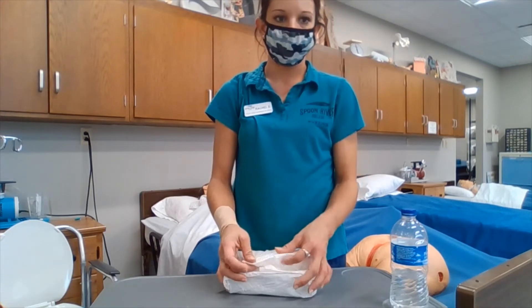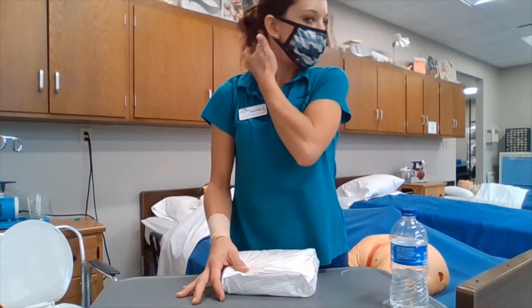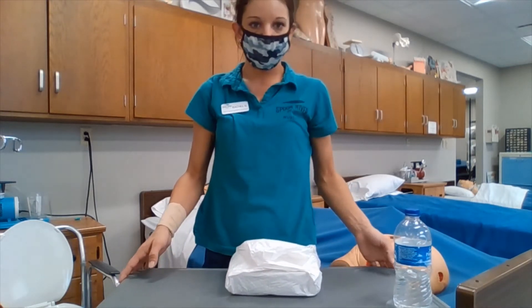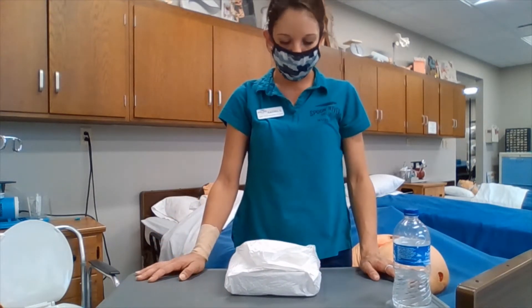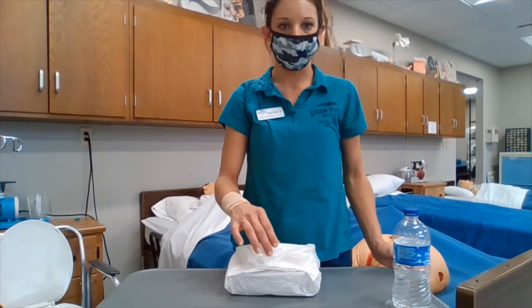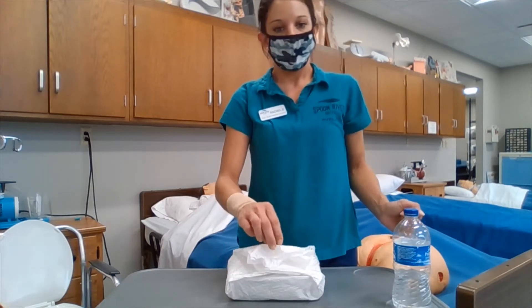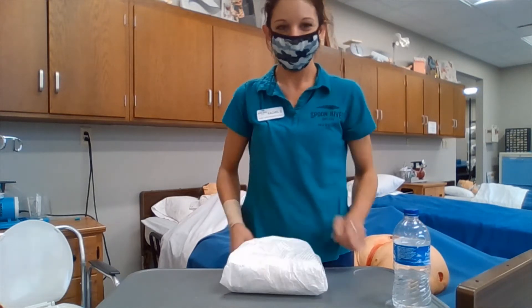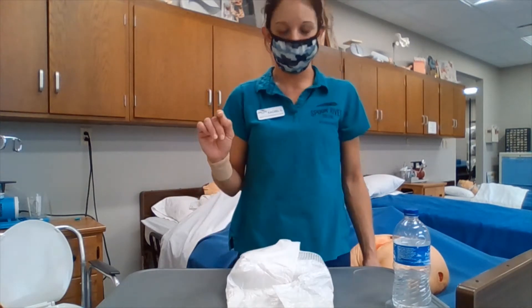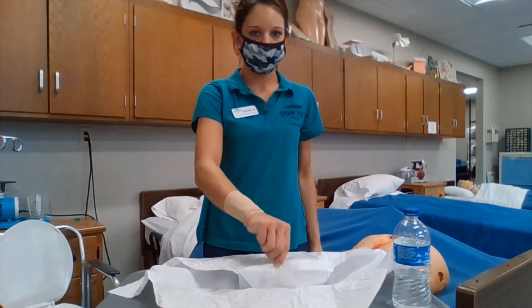This is going over the application of the sterile wet-to-damp dressing. The first thing we are going to do is open our sterile field. In doing so, we follow these steps: first away from me, then away from the patient, then towards the patient, and finally towards me.